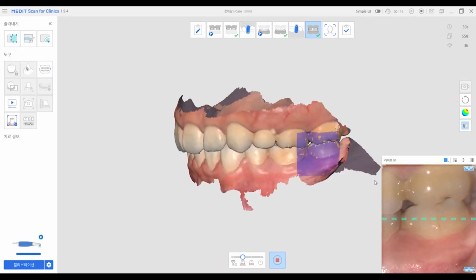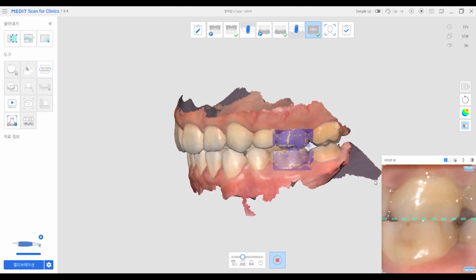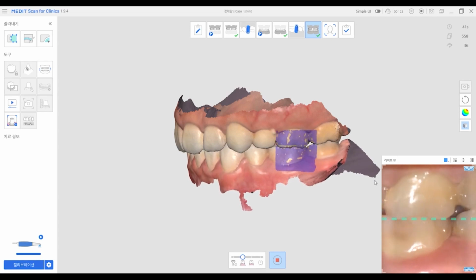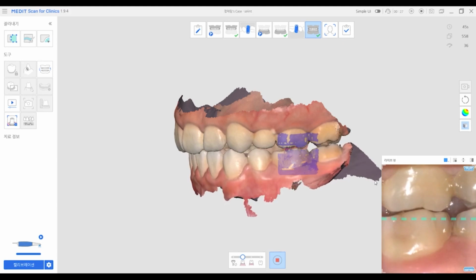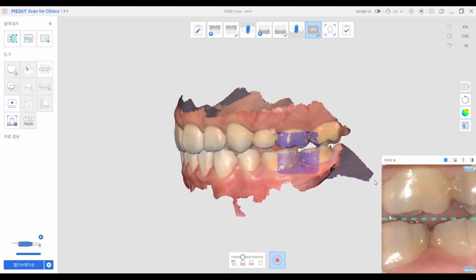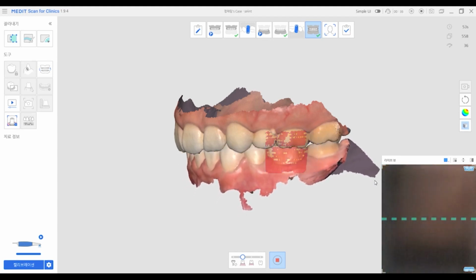Mandibular movement recording is a crucial technique for reducing occlusal adjustments in splint design by precisely documenting how the jaw moves in all directions without opening the mouth. This method allows for a more accurate assessment of the patient's occlusion, capturing the natural dynamics of jaw movement.